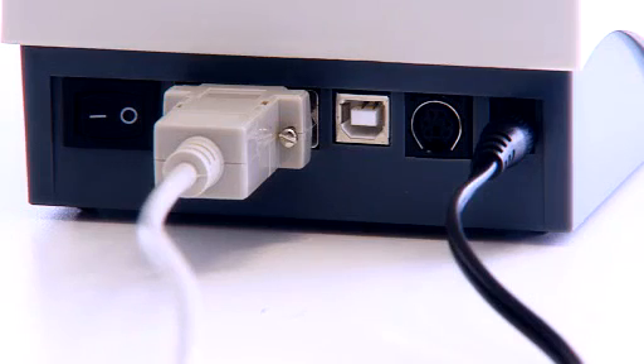Connectors for an external keyboard or barcode reader, and a connector for the laboratory information system or PC, come as standard.